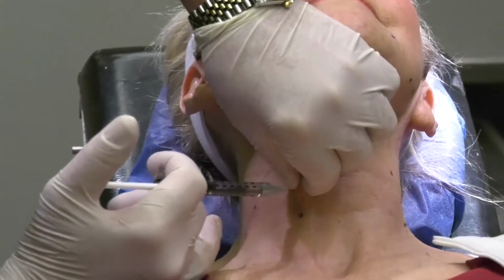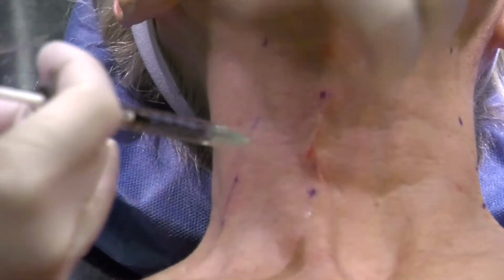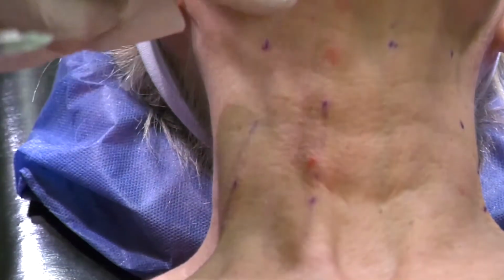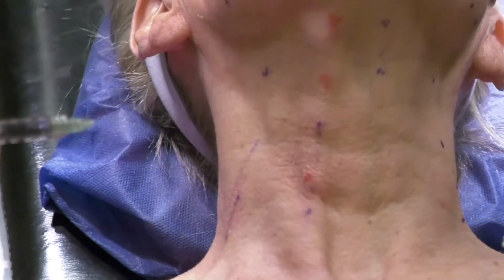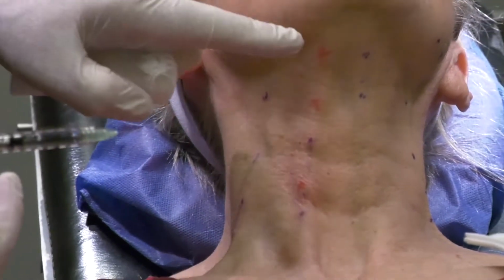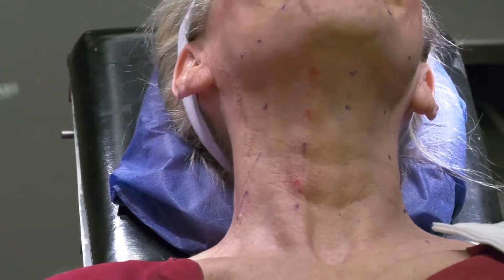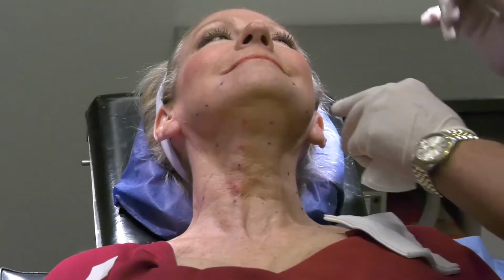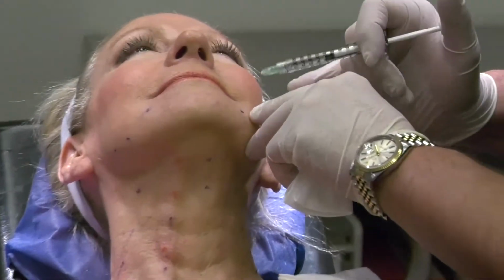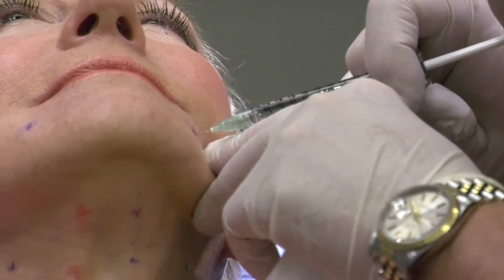And obviously, as you can see, I have preferentially injected much more on the right side, because the right medial platysmal band is much stronger in Barbara's case, so the dosage is much higher on the right side versus the left. Again, 2 points, 2 units into the DAO.